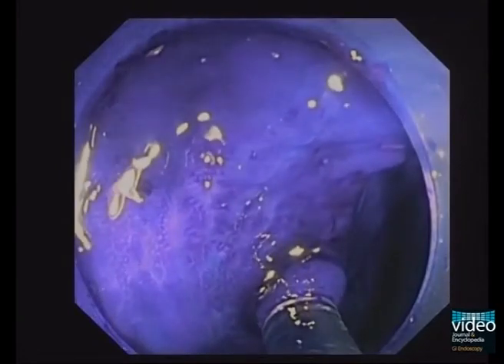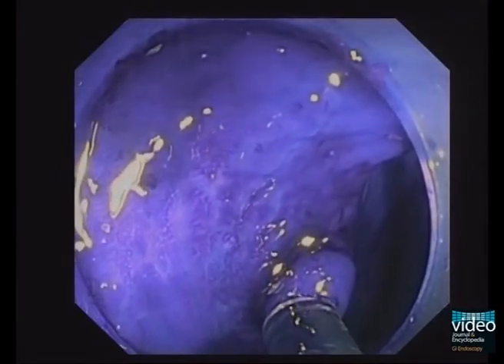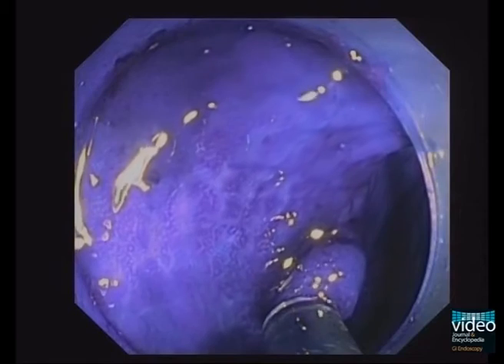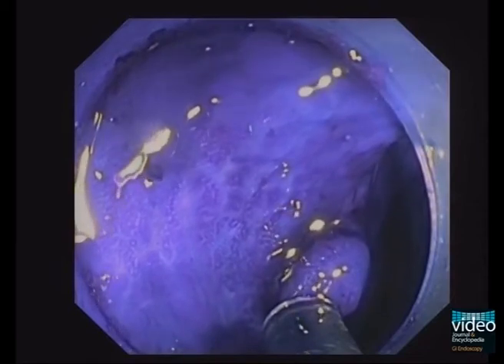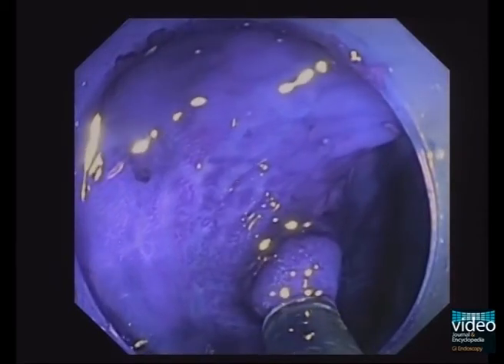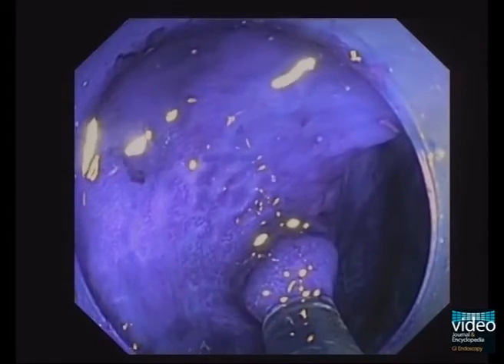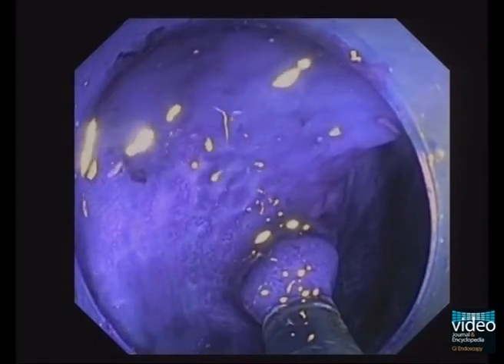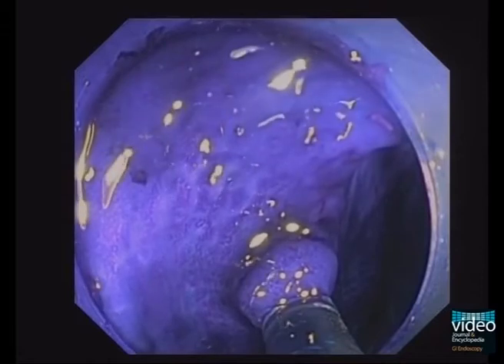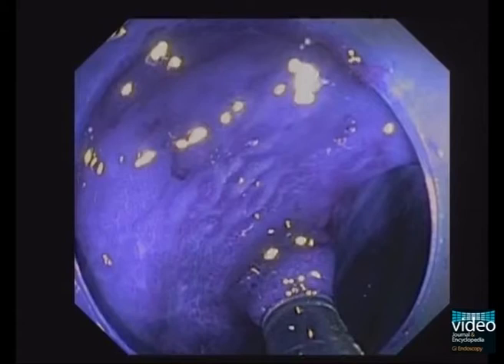The endocytoscope probe is then passed through the working channel and is gradually maneuvered until the tip approximates the mucosa, allowing endocytoscopic images to be obtained in real time. It is sometimes necessary to fit a transparent cap at the tip of the endoscope to fix the mucosa to the endoscope, enabling the probe to obtain crisp images.